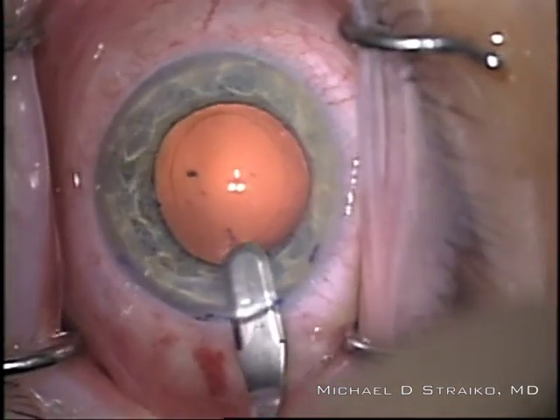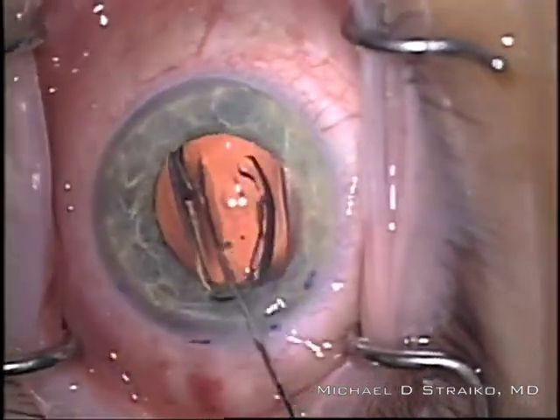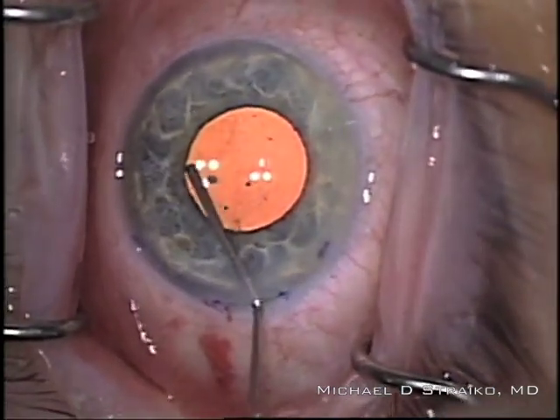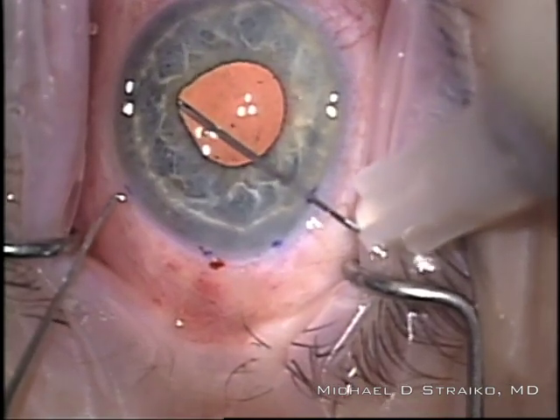I do enlarge the wound slightly because I'm going to have to enlarge it for the injector later anyway. Through that incision, I place the intraocular lens. I'm using a little Healon to elevate the iris, and now I'm going to go into that little pocket with a 30-gauge needle that I've bent the tip on.